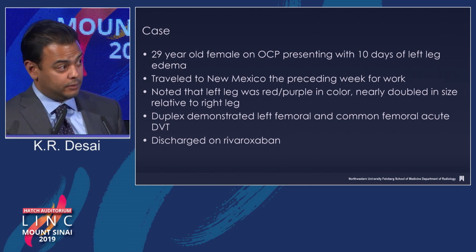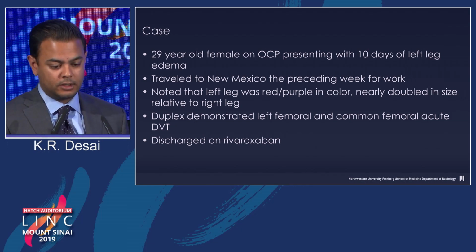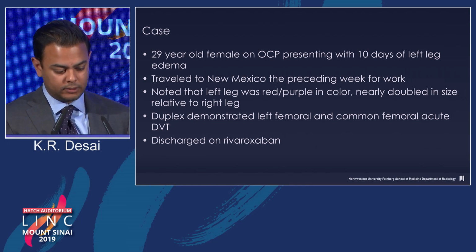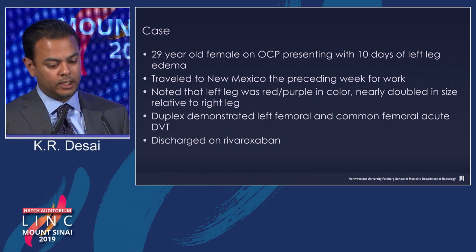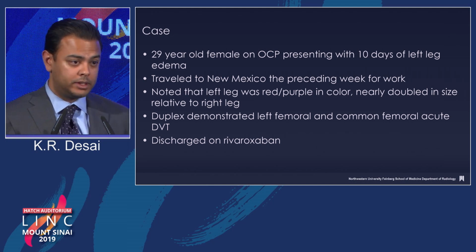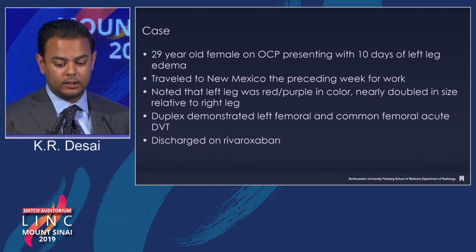So my case is relatively fresh, about 2 weeks ago. This is a 29-year-old female on oral contraceptives who presented with 10 days of left leg edema. She was traveling to New Mexico the preceding week, and she noted there that her left leg was red and purple in color, potentially may have been phlegmasia. I didn't see her at that initial presentation; the leg had nearly doubled in size.